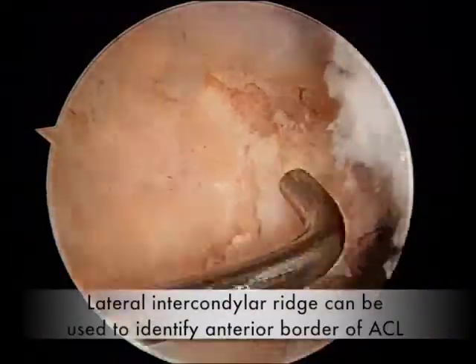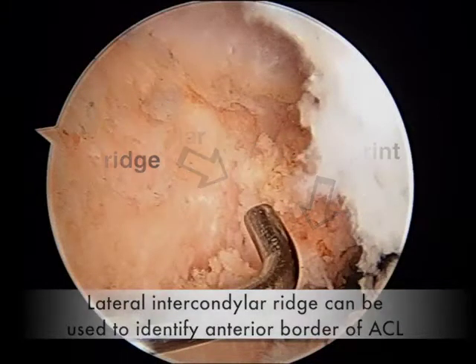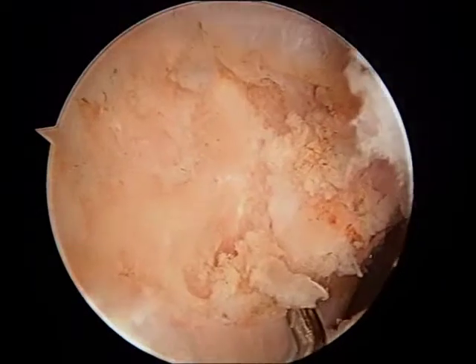We go further distal, and we are able to see the lateral intercondylar ridge, which we have cleaned off. And again, we see ACL remnants above and below the swath we have cut.